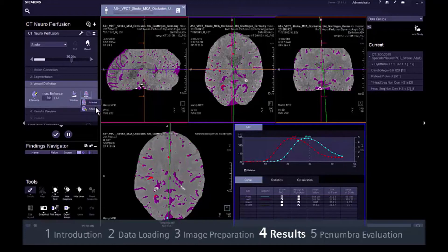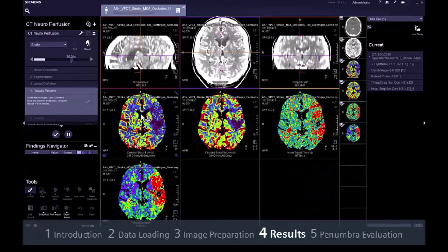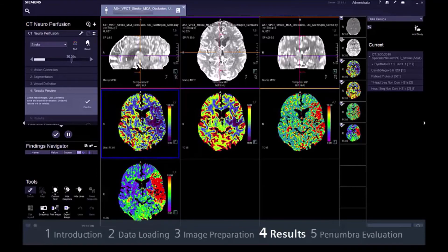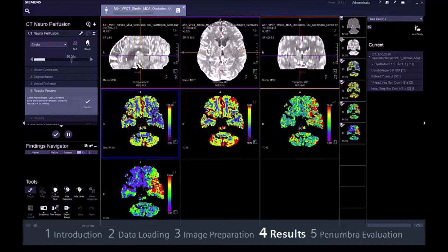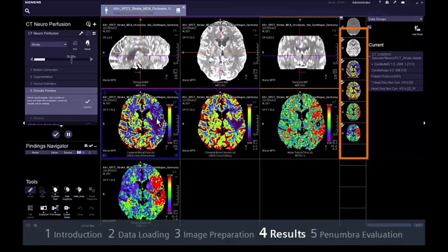If you are satisfied with all inputs in Step 3, go on to Step 4, Results Preview. In this step, you can quantitatively assess the result volumes to ensure that they are adequate for further evaluation and archiving. Just make sure that the volumes that you want to proceed with are selected.